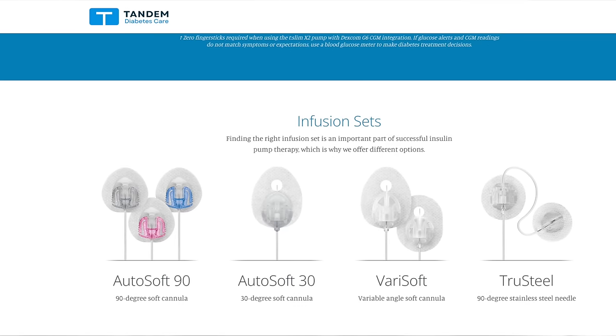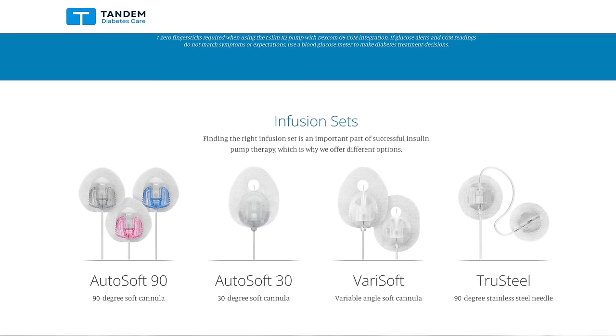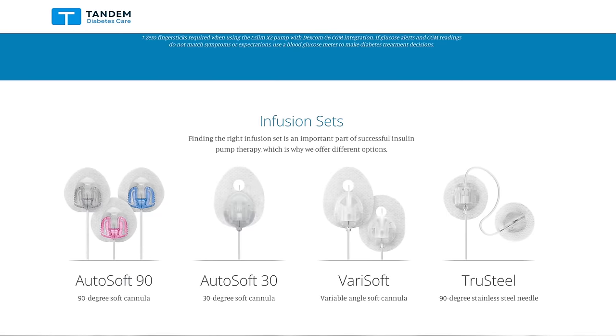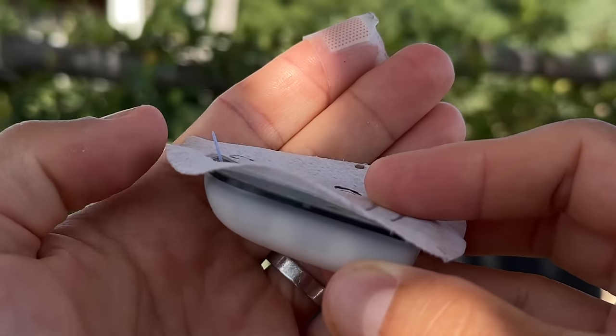A big plus of T-Slim X2 is the choice of infusion sets: Autosoft 90 with soft cannula at a 90-degree angle, Autosoft 30 with soft cannula at a 30-degree angle, Verisoft with a variable-angle soft cannula, or TruSteel which uses an actual needle. With Omnipod 5 you only have one choice — the soft cannula that's part of the pod. Some people prefer steel cannulas because they're more gentle to skin tissue, and with Omnipod 5 there are no steel cannulas, so keep that in mind.